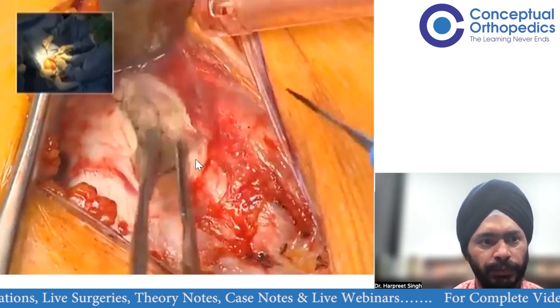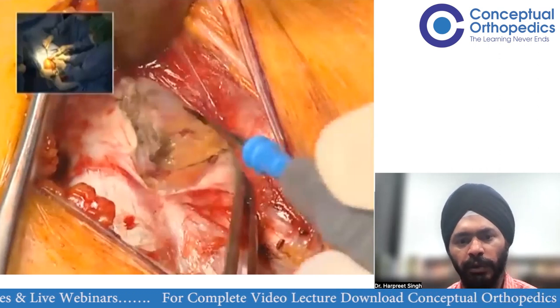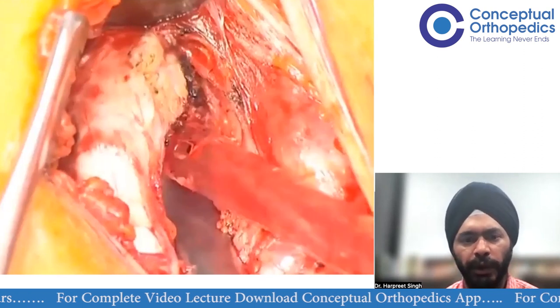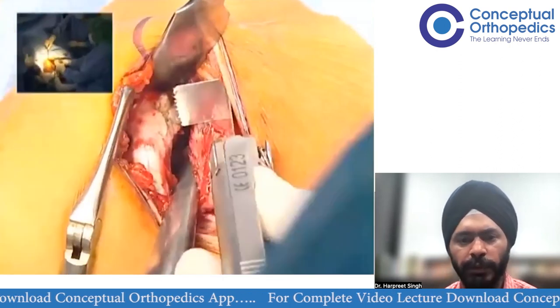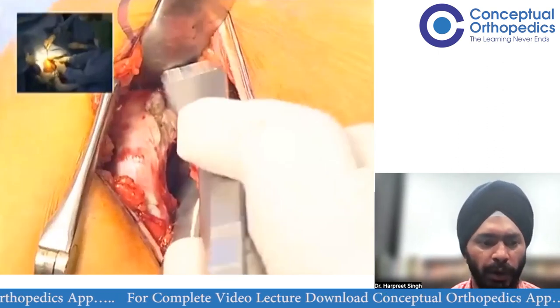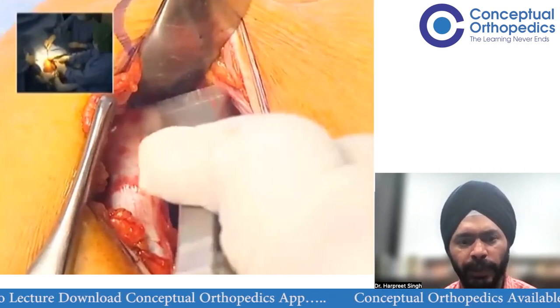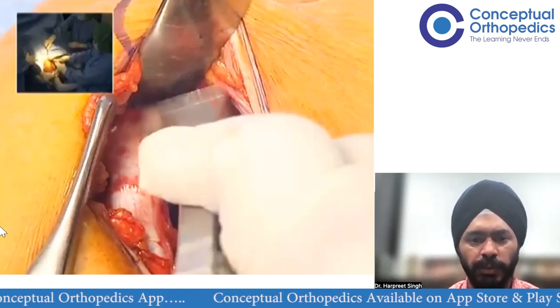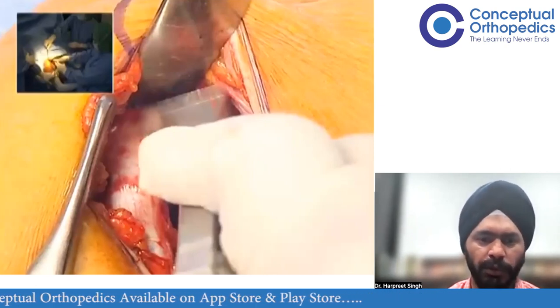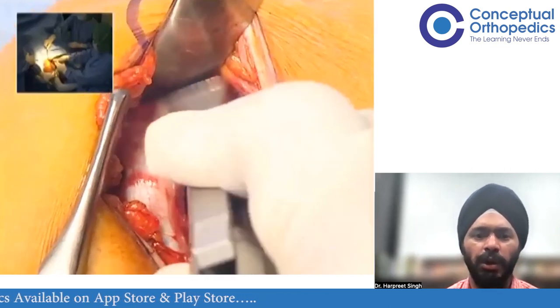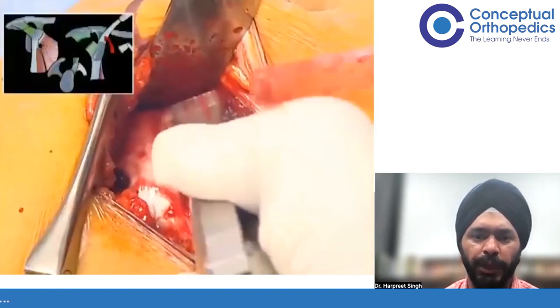The coracoid has now been cleared — pec minor removed medially and the coracoacromial ligament cut laterally. We now use a saw; a right-angle saw is best, though any saw can work. Cut the coracoid as near its base as possible — go as proximal as possible — and always cut from top to bottom and from medial to lateral. Walsh is using his right-angle saw to cut the coracoid at its base, cutting from superomedial to inferolateral.